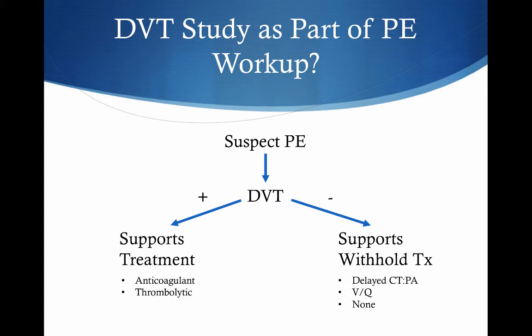Again, that's beyond the scope of what we want to talk about now, but it's something to think about, and this is how you can use the DVT study as part of this workup. If you suspect PE and you do the DVT study of their legs and it's negative, then that supports you in a decision to withhold treatment.